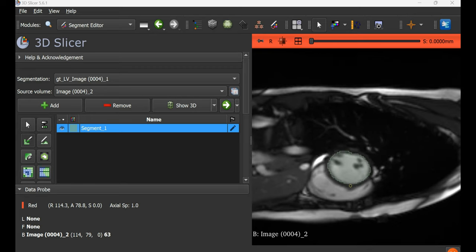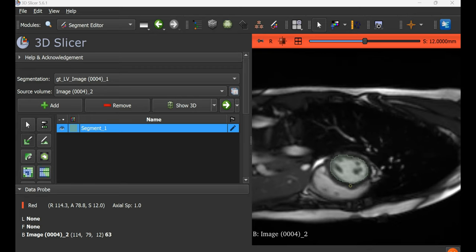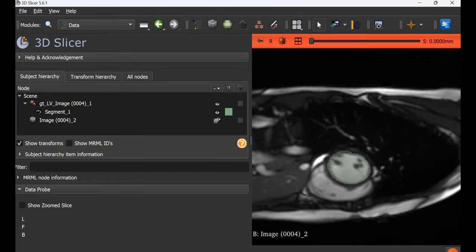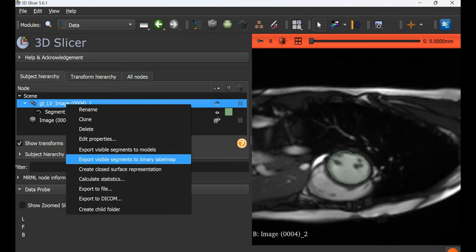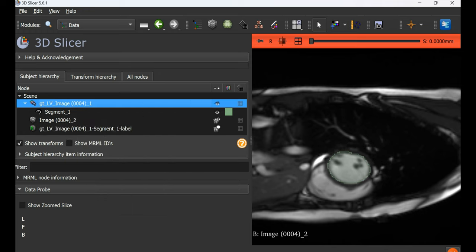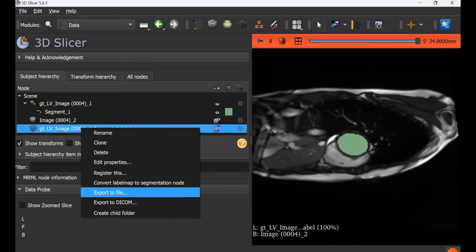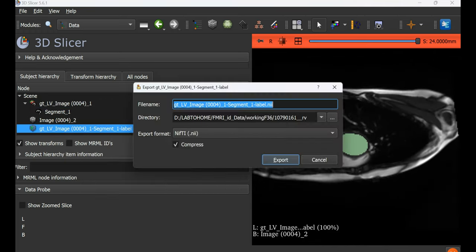To save this new version of the segmentation, go to the data module, right-click on the mask, export to binary label map, and then save as a NIfTI file or any other file format of your choice.